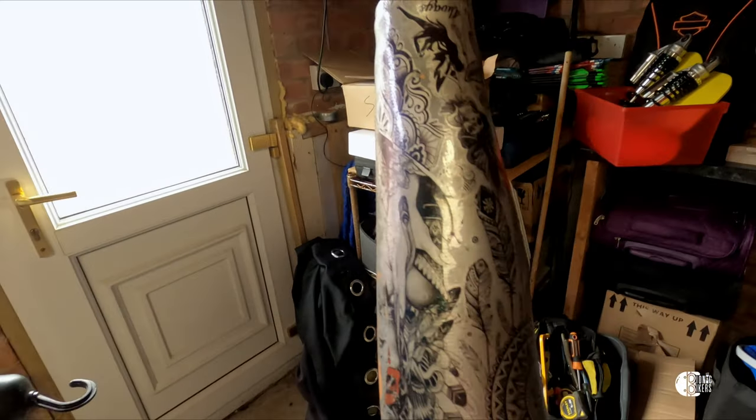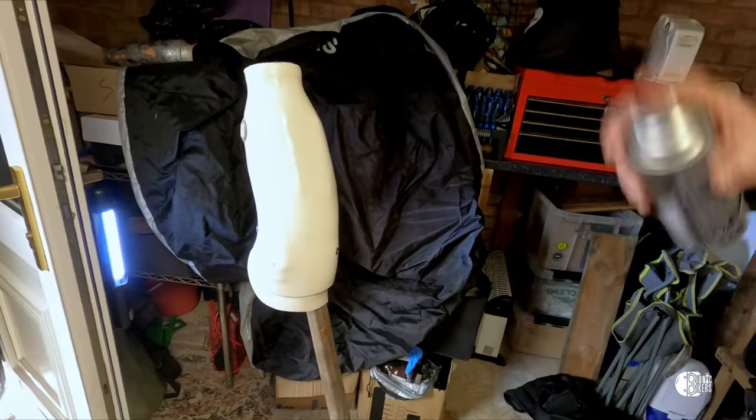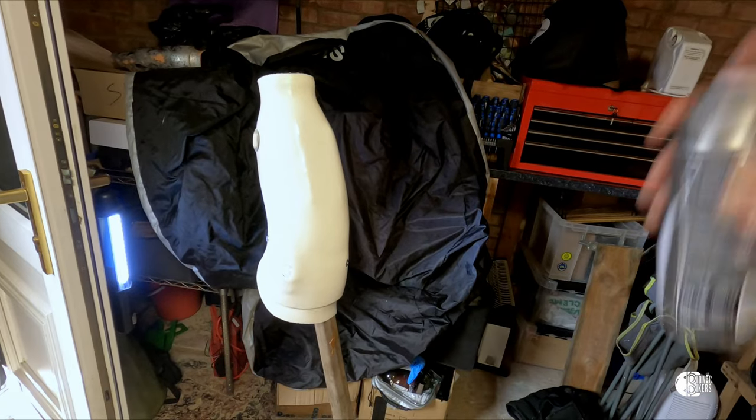I've got to put it there because otherwise I can't see you. It's called the prosthetic cast. In other words, part of the bionic arm. This is the bionic arm being in design mode. There you go, Liz. You can hold that. Ready? Straight over this. Yep.